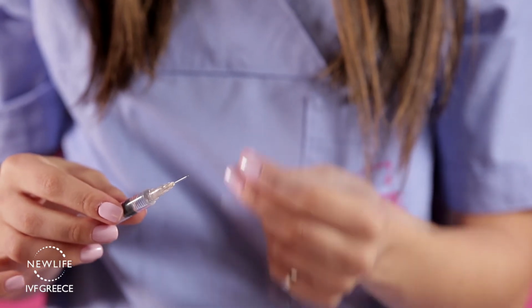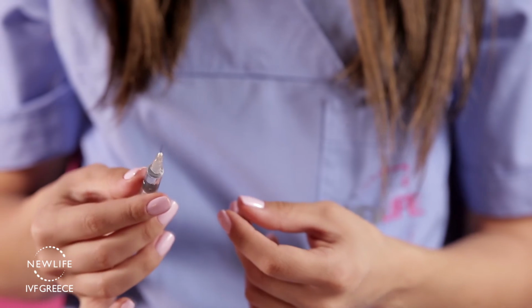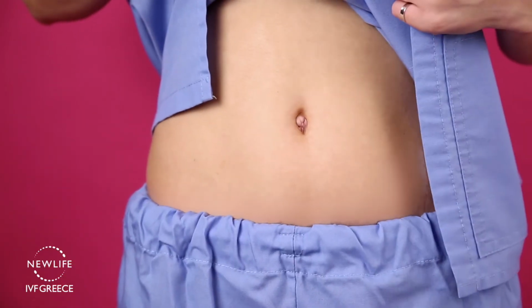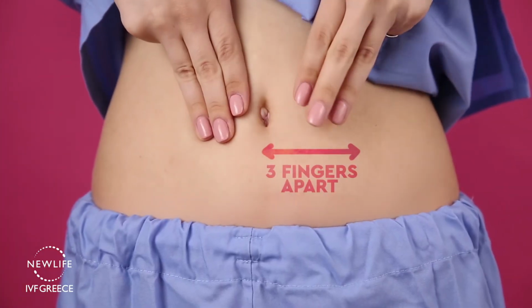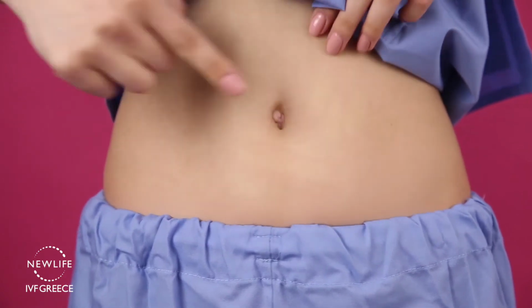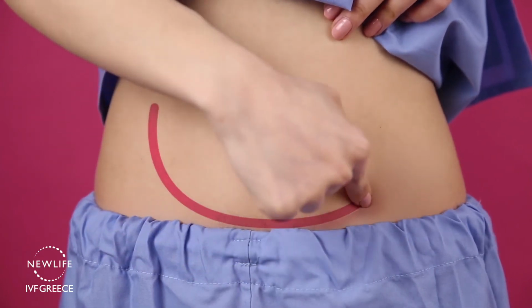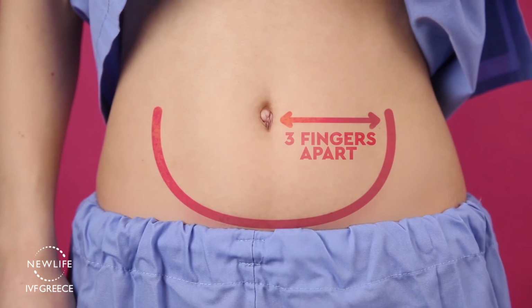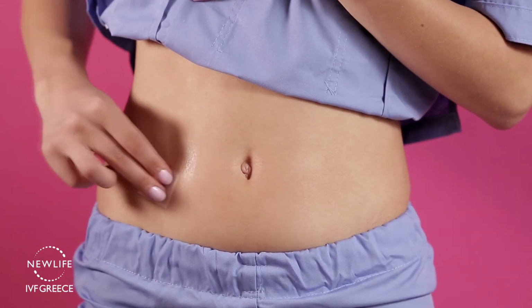The small needle is designed to deposit the medication subcutaneously, and thus you will need to insert the whole needle into the skin. Subcutaneous injections are performed in the lower abdomen. Use 3 fingers placed under the belly button to find the location of your injection. Please note that it is important to alter injection site. When you choose your injection spot, take an alcohol swab and thoroughly clean the injection site.